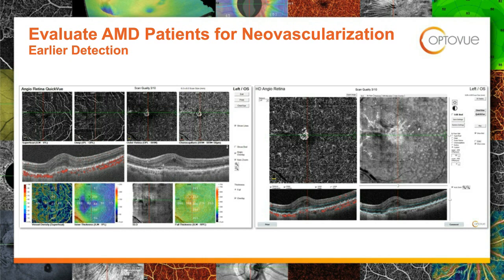And if you go right above to that third image over, you can see the red line and the green line going right through that area, depicting right where that choroidal neovascular membrane is. And the image on the right side there, again, the red line and the green line go right through that choroidal neovascular membrane. You can see the scan down below with the AngioAnalytics, the red activity, the hyperreflectivity, and that's how you can tell, for the doc out there that had the question, between active and passive.